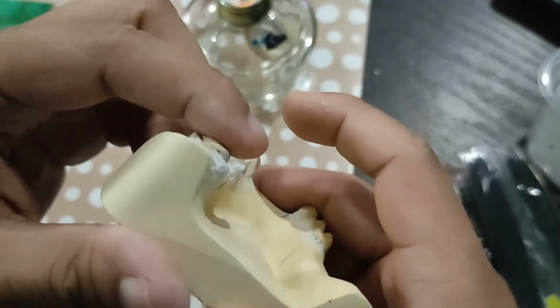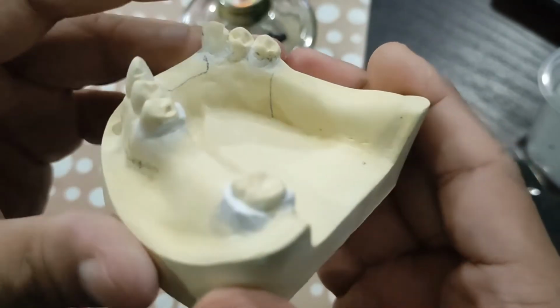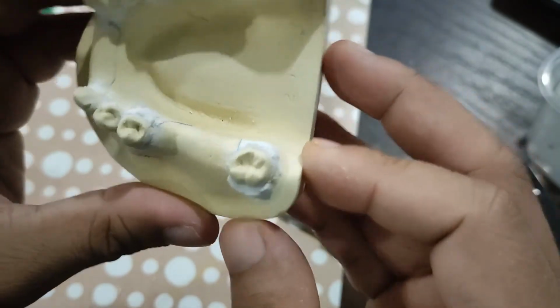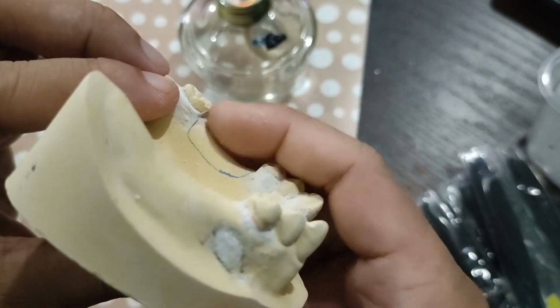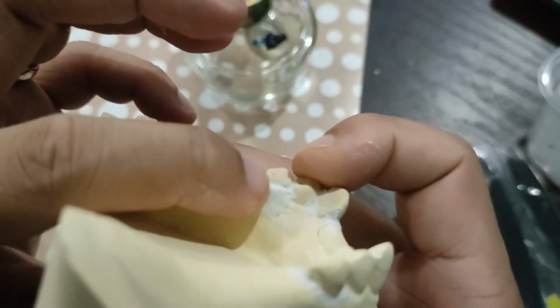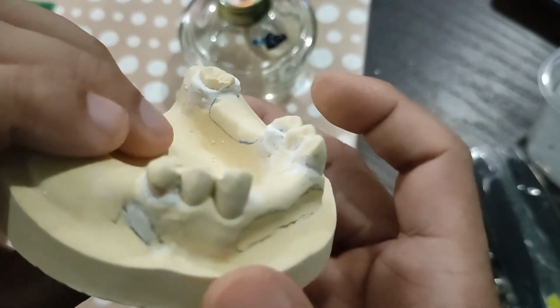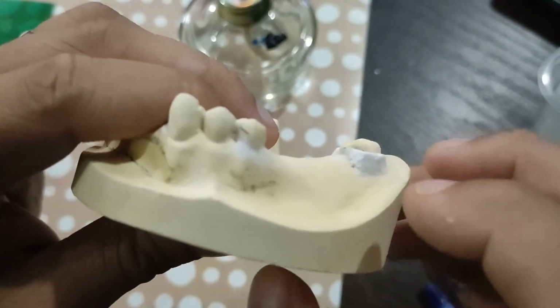Okay, so this is another example of a shape blockout. Notice how thick it is on all sides, right? Again, on the buccal and on the lingual. You have to make shape blockouts for both reciprocal and retentive arms. For this premolar, I only did a shape blockout on the lingual because on the facial or on the buccal, I'm planning to do a gingivally approaching clasp.